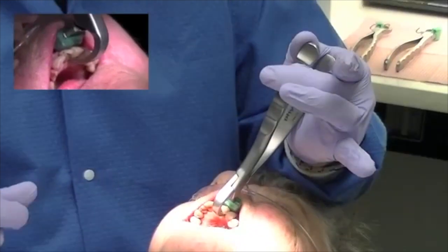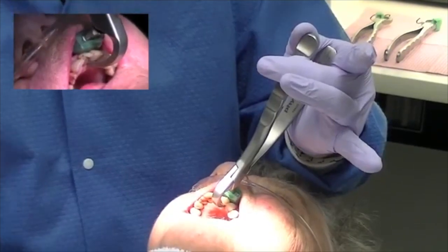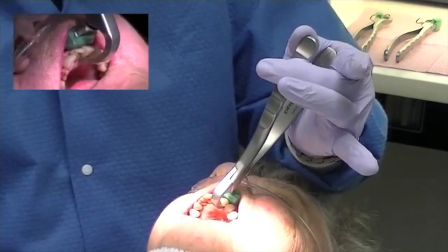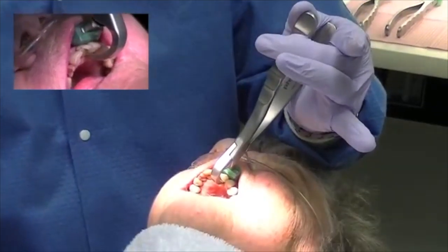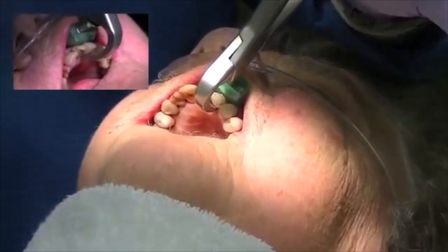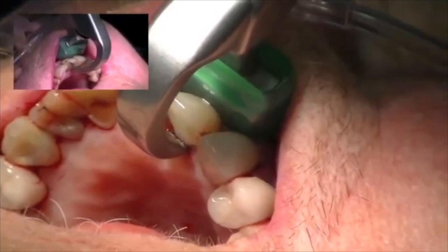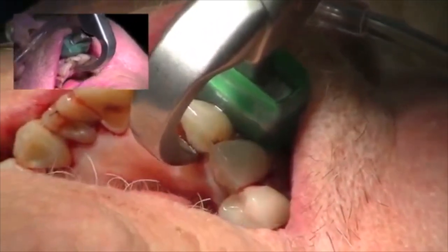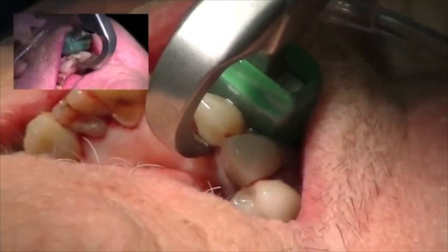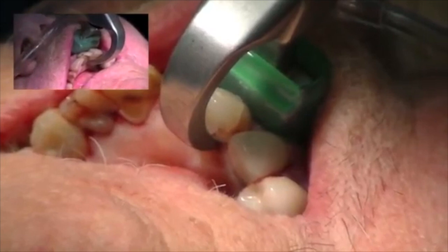It's very, very critical that you don't squeeze the instrument. This is not a traditional forcep where we're using a lot of physical force to remove the tooth. We're not using a figure-eight motion or a buccal-lingual motion. What I'm doing is placing the beak onto the palatal bumper as high up the vestibule as possible, and then I'm simply rotating my wrist. There's no forearm, no bicep, no shoulder pressure — I'm rotating my wrist towards the corner of her left eye.